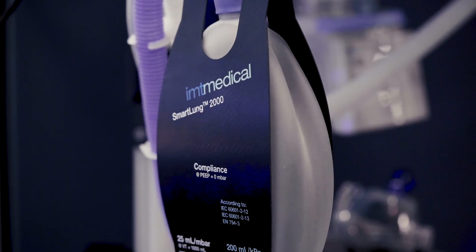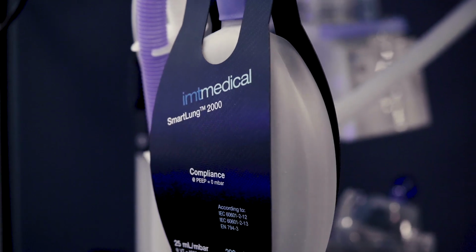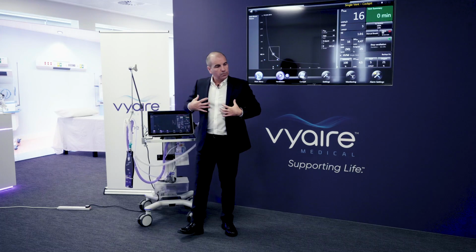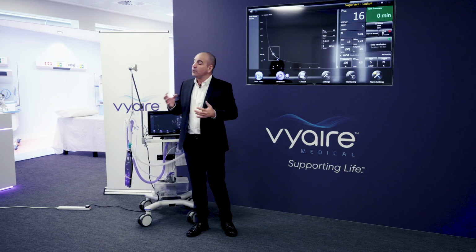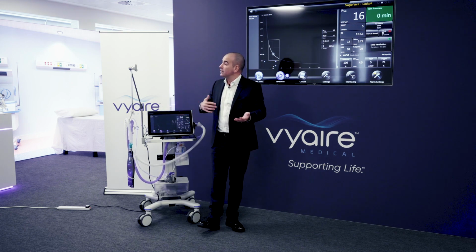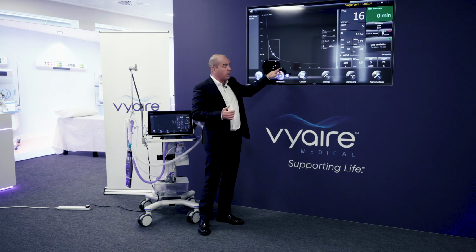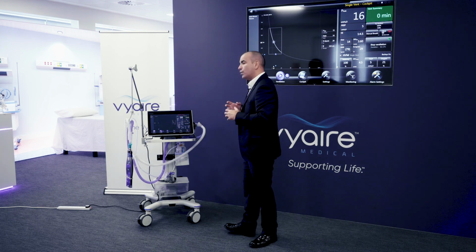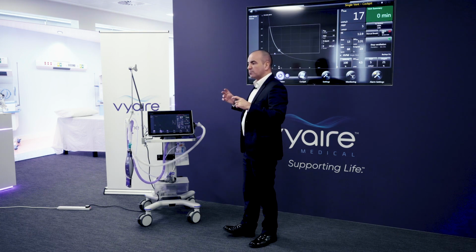Similarly, if the patient's lungs became stiff, then when you think about the lungs, you don't want to squeeze potentially large volumes in, so you might want to take a different approach, i.e. smaller volumes, but more of them. Okay? So you can protect the lung, because you don't want to damage the lung. So what you'll see here is that the rate will start to increase and the volume will drop. So that's what we want to see. So this protective frame is going to change its shape, essentially.